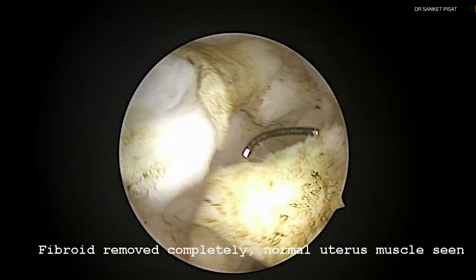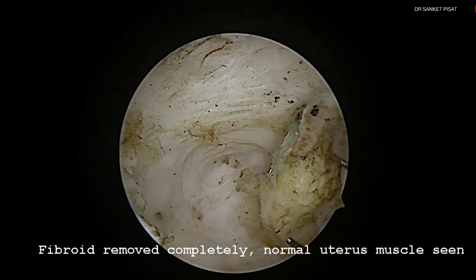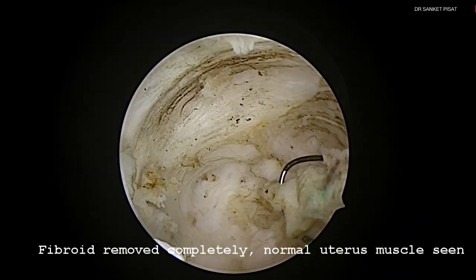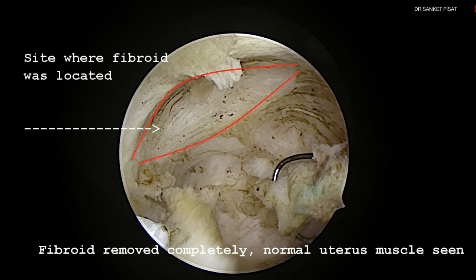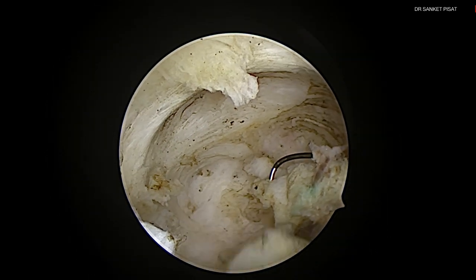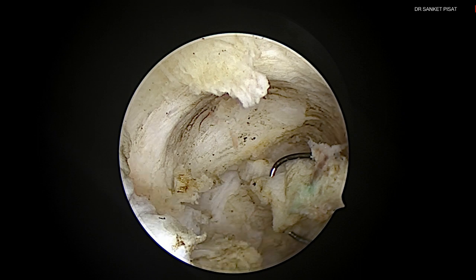Here we see that the fibroid has now been completely removed and the normal uterine musculature can now be seen. This site of the fibroid where it was earlier located is marked out by the two red lines. Hence the fibroid has now been completely removed and the patient will have complete relief of symptoms from the next cycle onwards.